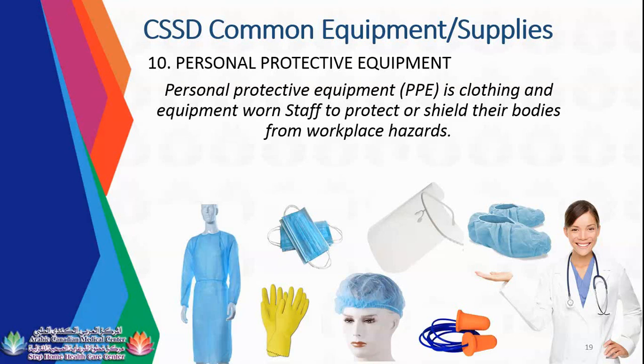The reason why you need to put earplugs is because, as per OSHA guidelines, if the sound generated from an equipment is above 85 decibels, then you need to protect your ears to avoid any hearing problems sooner or later in your life. So, because the ultrasonic machine is very noisy and it cleans the instrument using sound waves, and when we check it, it is above 85 decibels, then you need to wear earplugs.